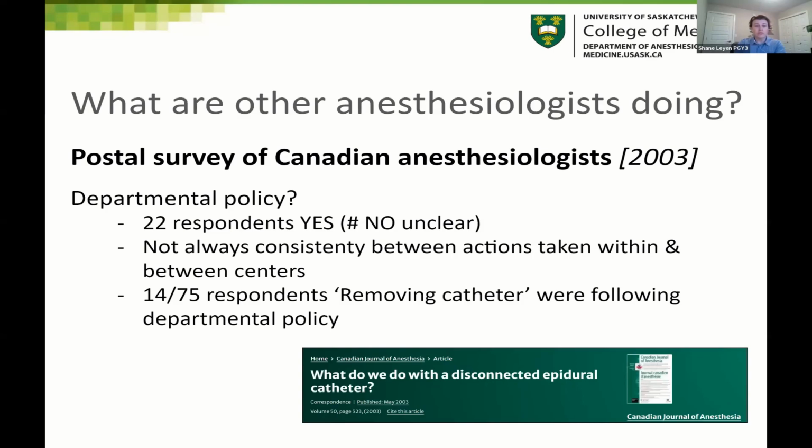The same survey asked about departmental policies. 22 respondents said yes. The article was unclear about how many said no. And interestingly, there was not always consistency between the actions taken, both within and between centers, and in regards to the actions taken relevant to a departmental policy. 14 of 75 respondents did state that removing the catheter was because they were following a departmental policy.